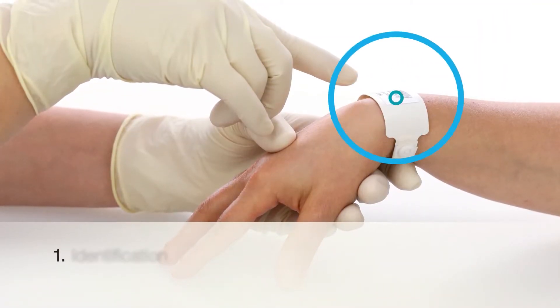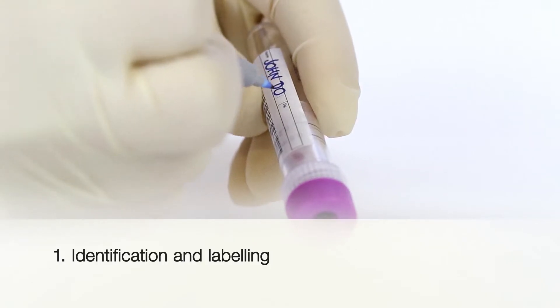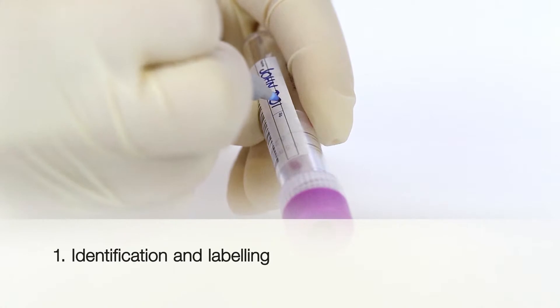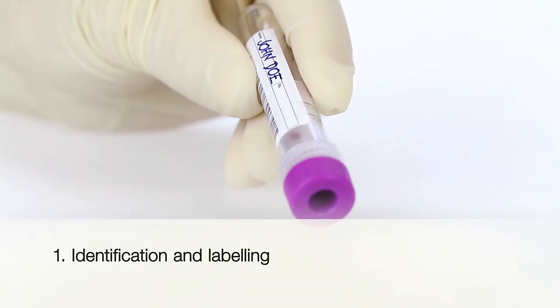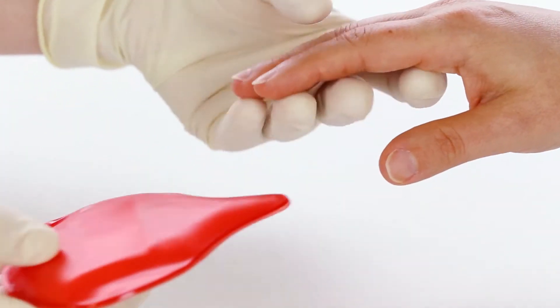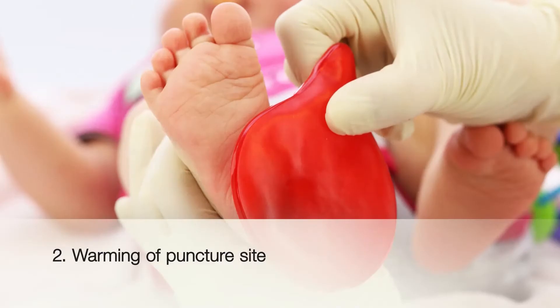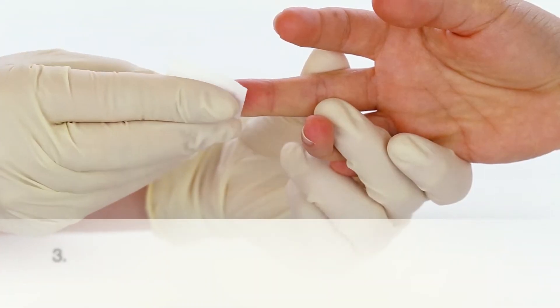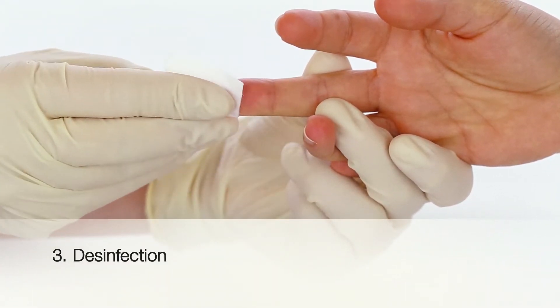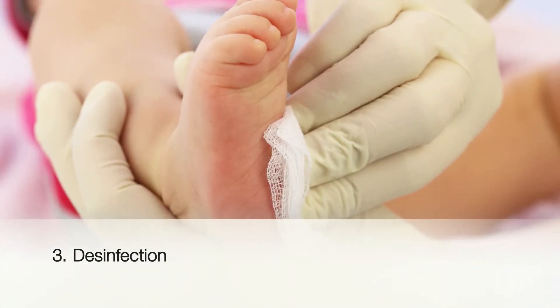Ensure that the patient is clearly identified before each puncture. Always follow the applicable guidelines in your institution to identify patients and label the sample containers. Prior to blood collection, it is recommended that the puncture site is warmed to help increase circulation. Simple heat packs can be used for this. Disinfect according to the guidelines of your institution and wait until the puncture site is dry.